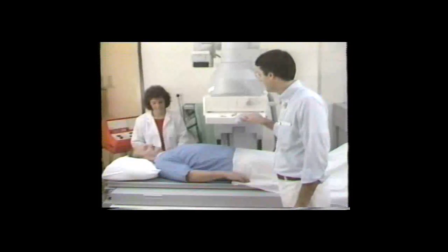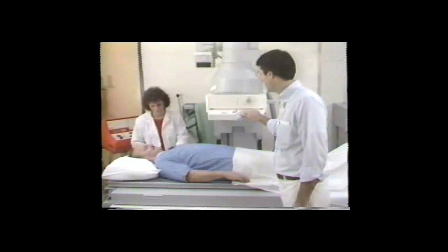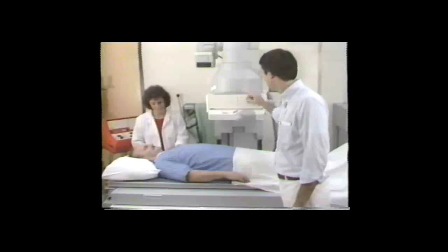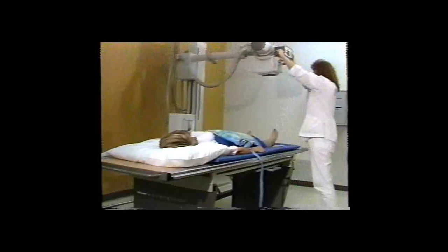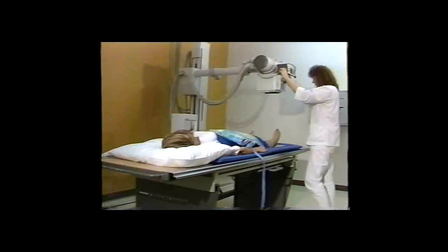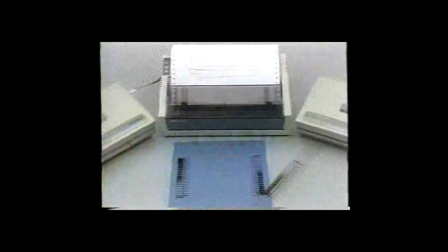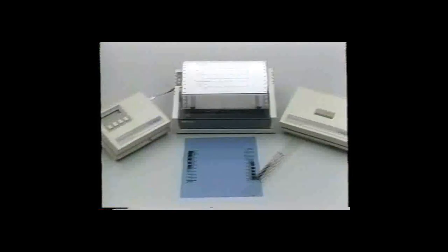Quality control of X-ray processing is becoming more of a concern to radiologists and regulatory agencies. Their goals are accurate diagnosis and minimum patient radiation dosage, particularly in mammography examinations. With this in mind, X-Rite created new technology — a system that would simplify the procedure and optimize performance.